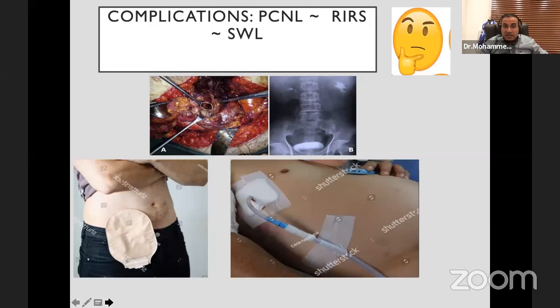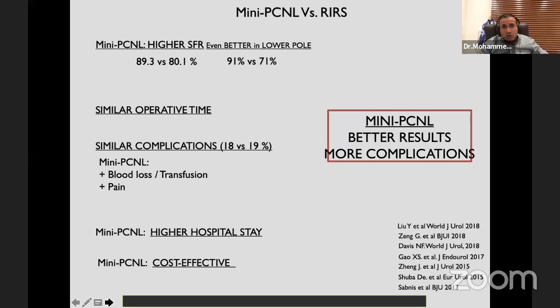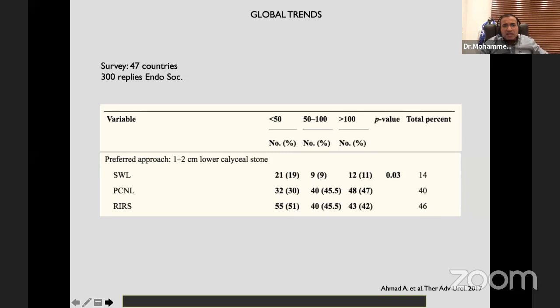It's very dramatic complications. It's not at all comparable to the complications of flexible ureteroscopy. Again, this is data comparing flexible ureteroscopy with mini PCNL, which I totally disagree with, especially with the stone-free rate now high with the high-watt lasers. And even the learning curve with flexible ureteroscopy nowadays is very easy, and you can do it even in the periphery, not only in heavy centers or high-volume centers.